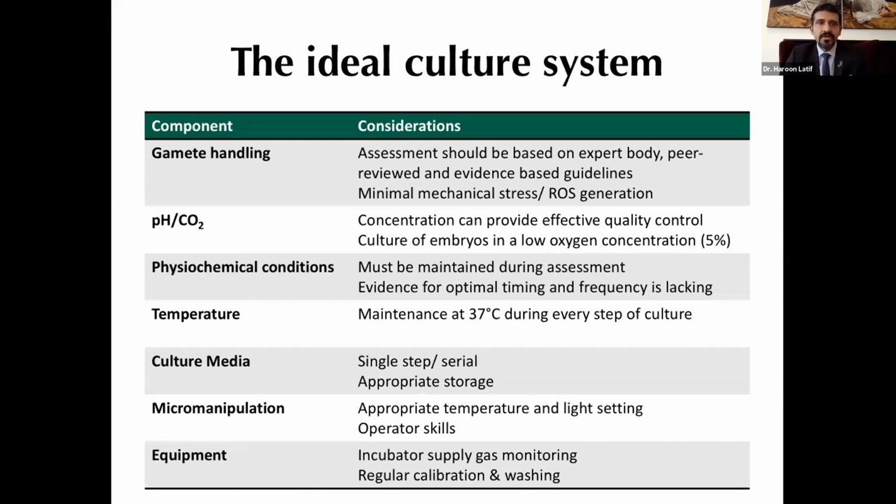Your gases, your CO2 concentration, your culture of embryos and low oxygen concentration levels, the physiochemical conditions have to be maintained and optimal throughout the procedures. Temperature is extremely important, as we all know. Your culture media, whether you're using a single step or a serial media, appropriate storage of the media and related things are important. Obviously, micromanipulation, which is heavily operator dependent, is also extremely important.